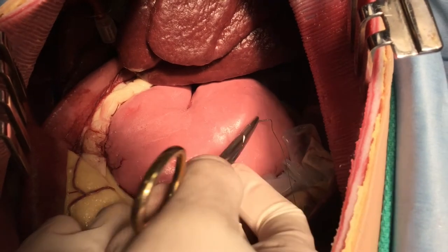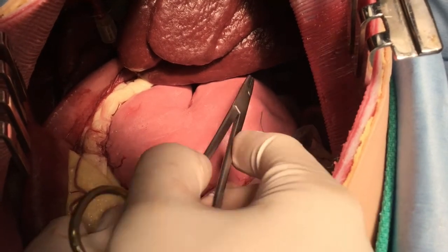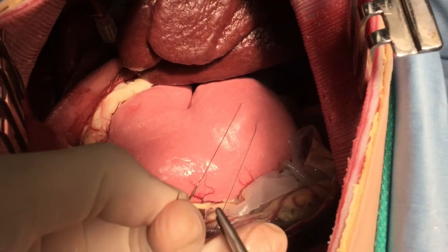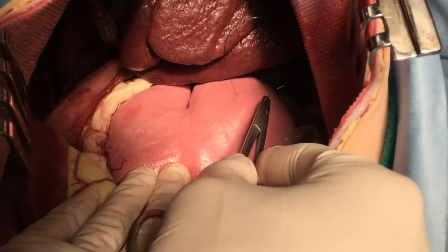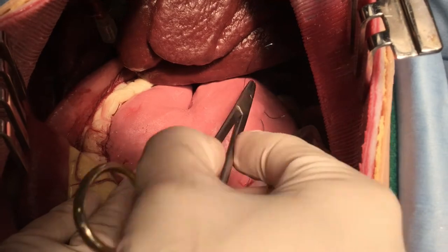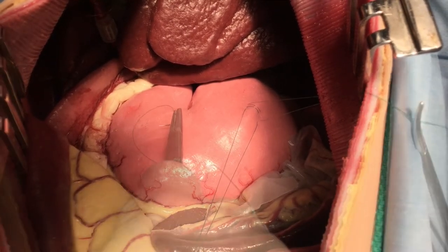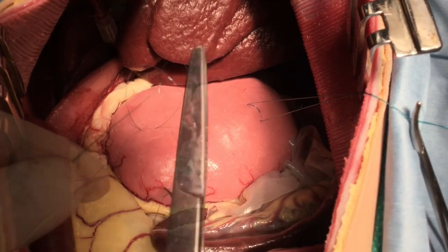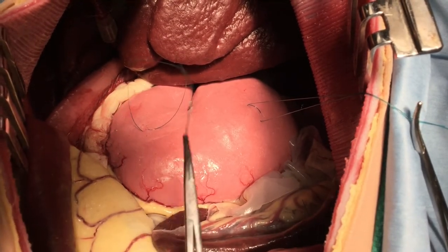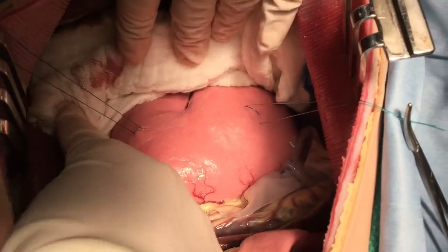To start, stay sutures are placed in the ventral aspect of the body of the stomach. Ensure that large bites are taken so that the stay sutures do not pull out when traction is applied. Two bites may be taken to further decrease the risk of suture pullout.